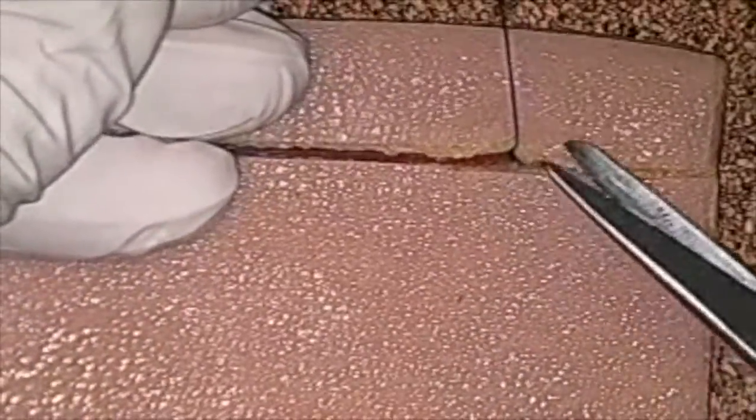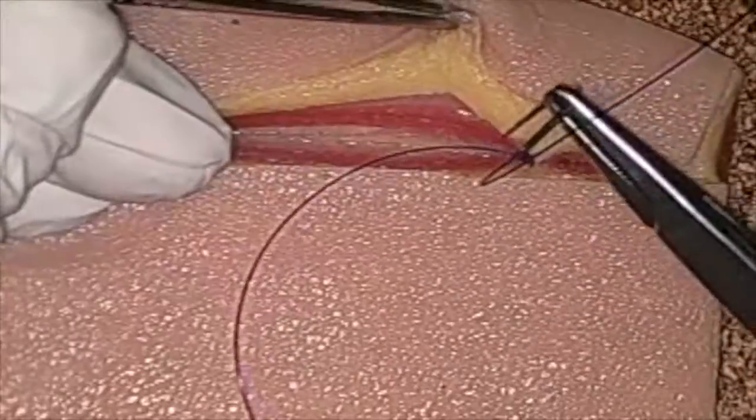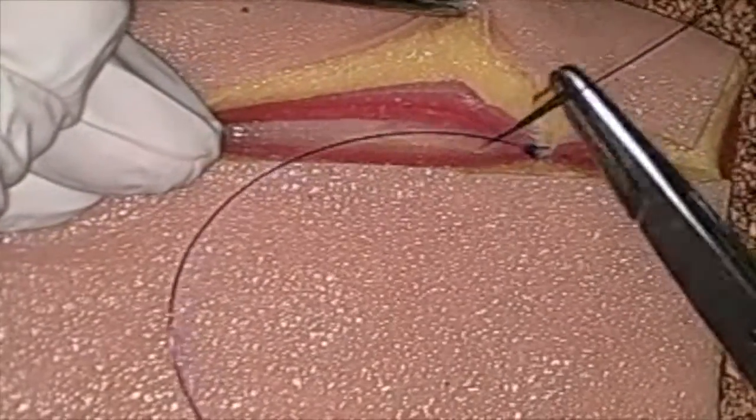If this was a linea, I would probably recommend that we did five knots on the starting knot, and then of course two more — seven knots on the finishing knot.